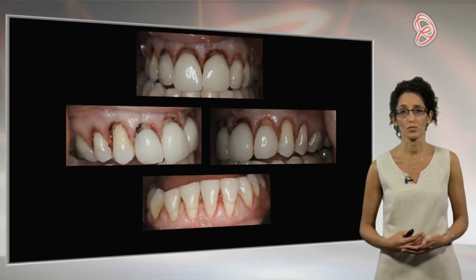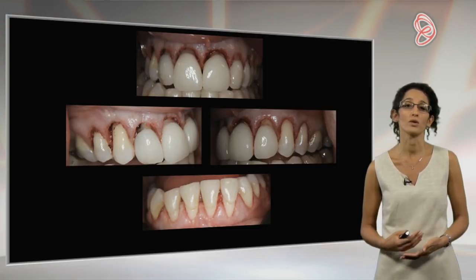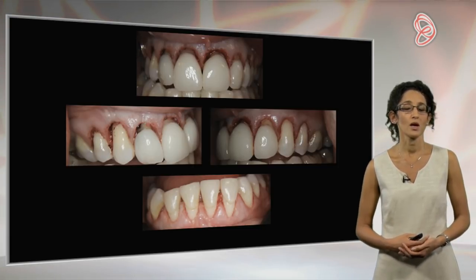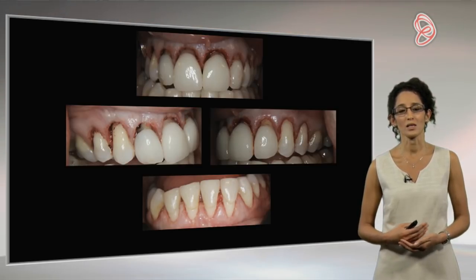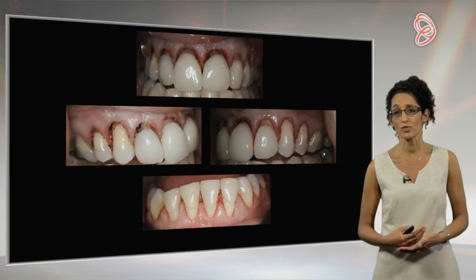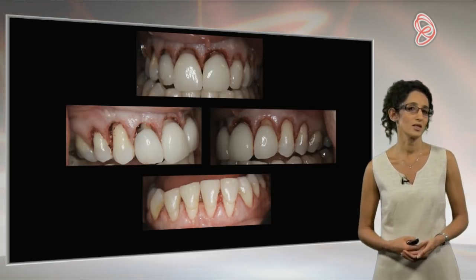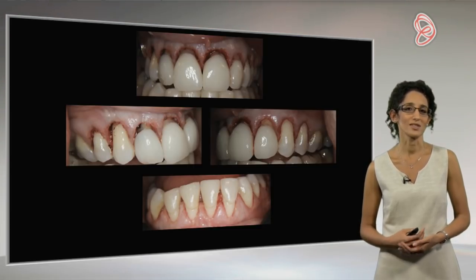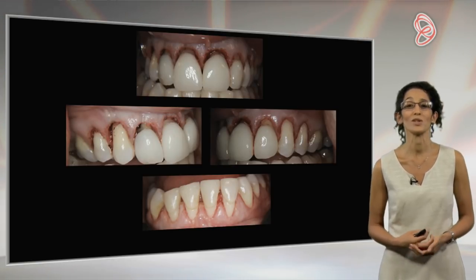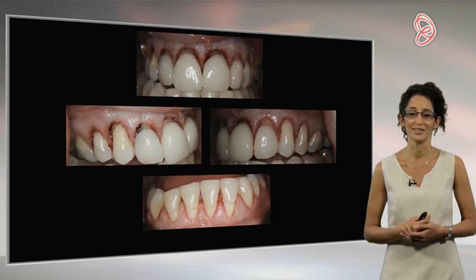We use lots of water here to make sure that we don't damage bone. And that's why we wouldn't use a diode laser. We just get too hot and cause bone necrosis. This bleeding tends to stop very quickly, and otherwise, if there's a bit of propensity for bleeding, all we do is just compression with gauze and send the patient home, usually with some kind of post-op instructions just to say, don't go crazy at the gym. And to be honest, most of my patients love me when I say that to them anyway, so I always seem to get a smile.